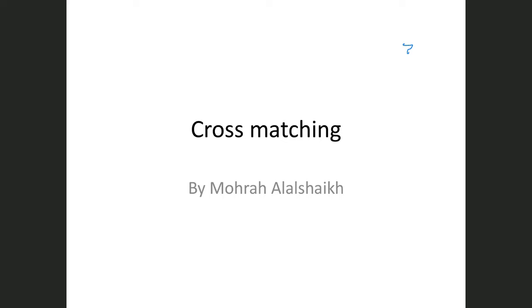So if we find that this patient, for example, has anti-small c, how can this information help me to provide compatible blood for this particular patient? Try. Yes, Samira. I give him blood that lacks the antigen, small c. Excellent, Samira.